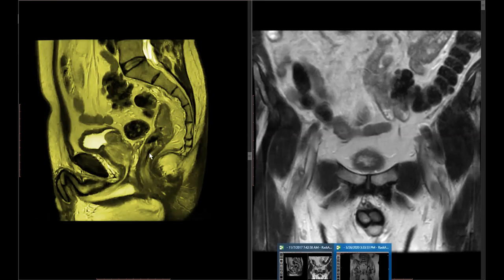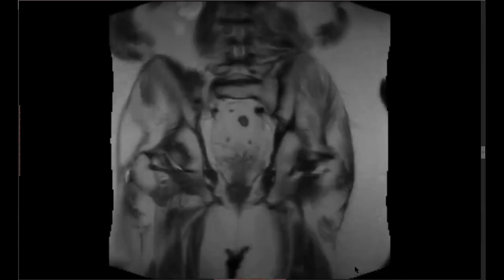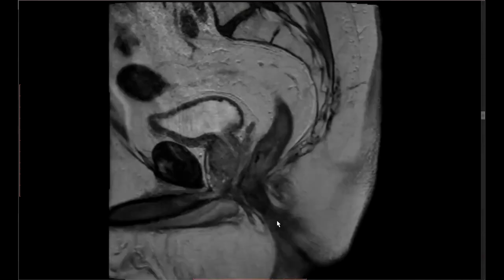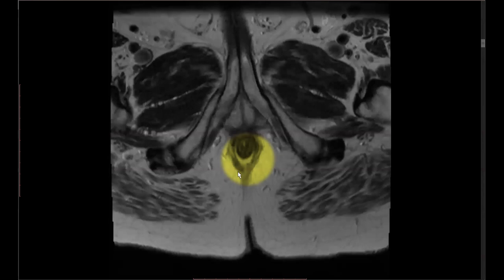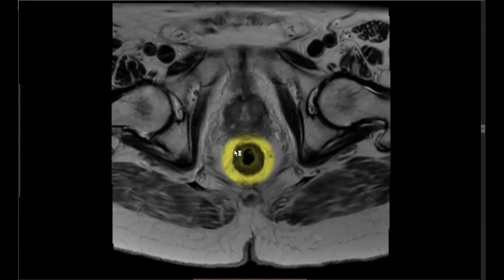Looking at the axial or oblique axial images, the rectal wall is composed of two parts: the outer dark ring, which is the muscularis, and the inner bright ring, which is a combination of the mucosa and submucosa. We cannot make a distinction between the mucosa and submucosa — they are combined into this bright ring. The outer darker ring is the muscularis. These are the two important structures you always need to identify because they govern the staging of the cancer.